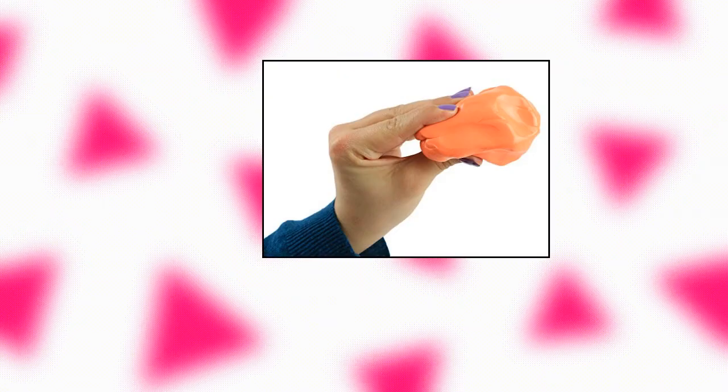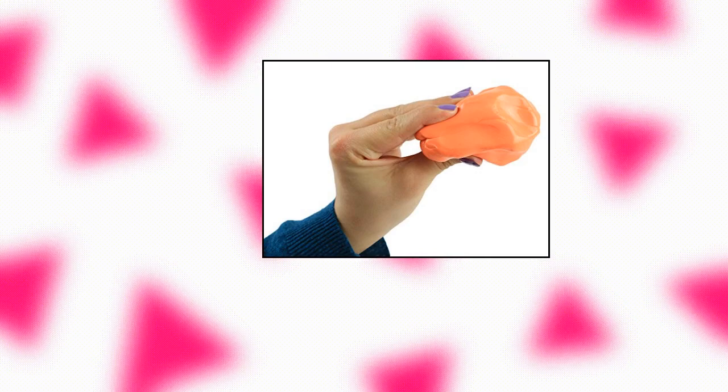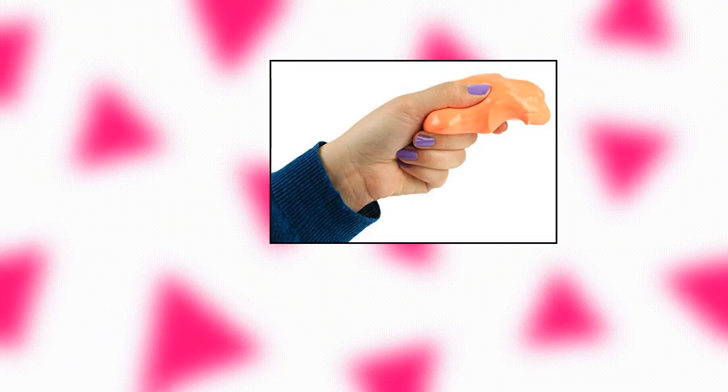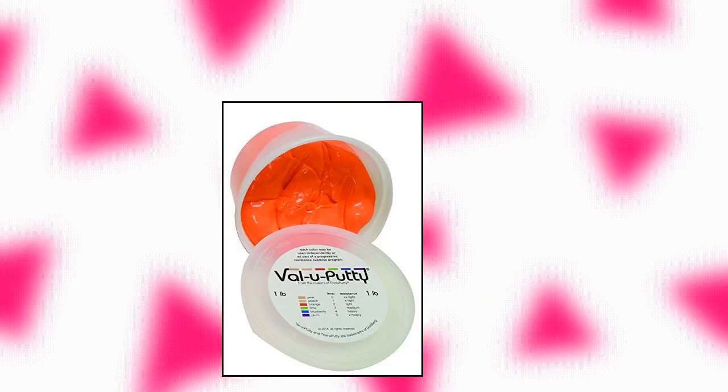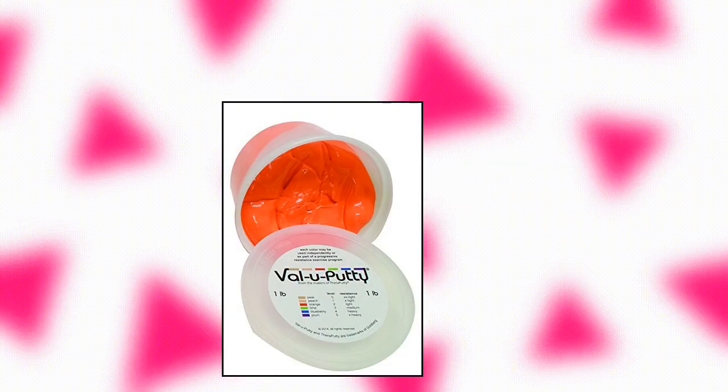Fabrication Enterprises 10-3942 Val-U Putty exercise putty, orange soft, 1 pound. Available in six resistance levels.